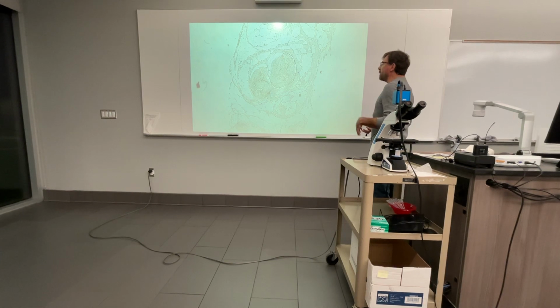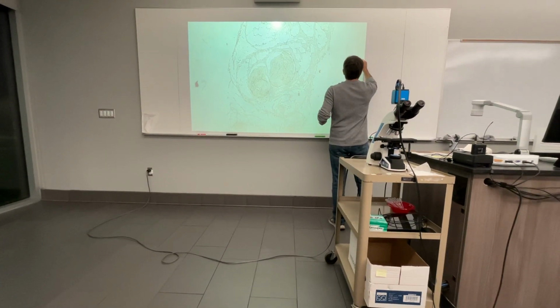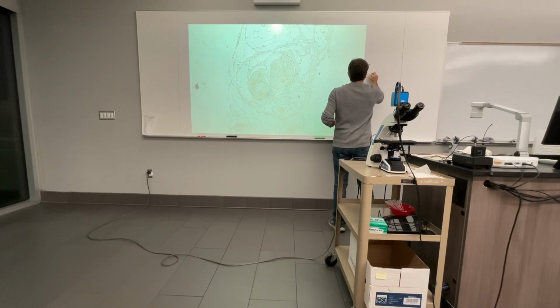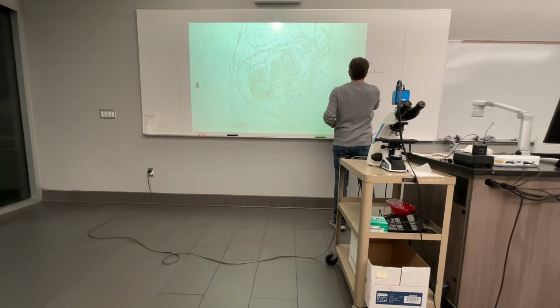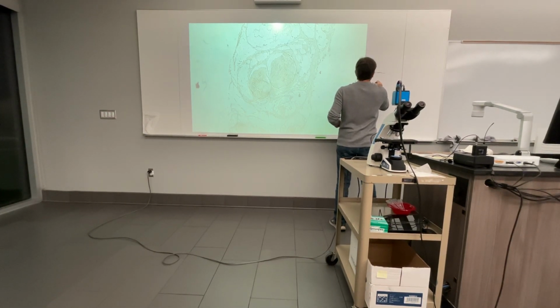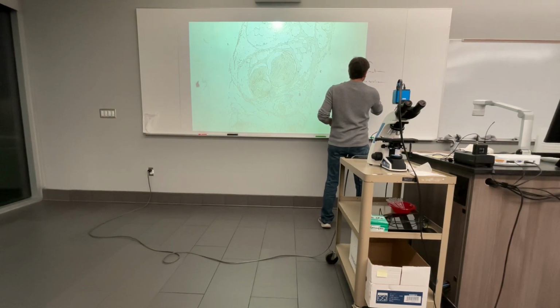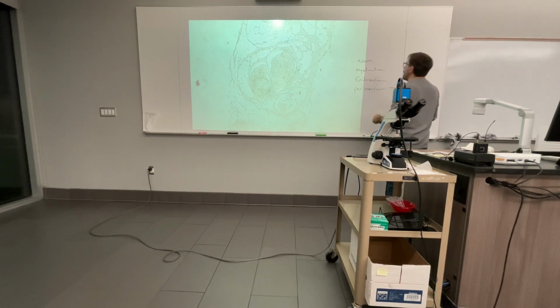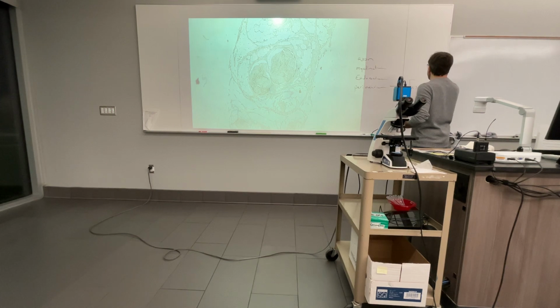We should be able to identify the axon, myelination, endoneurium, perineurium, which is going to be associated with identifying individual groupings that we're going to call fascicles.